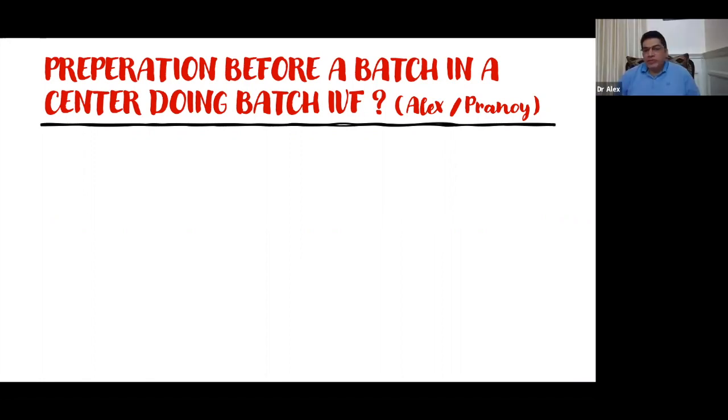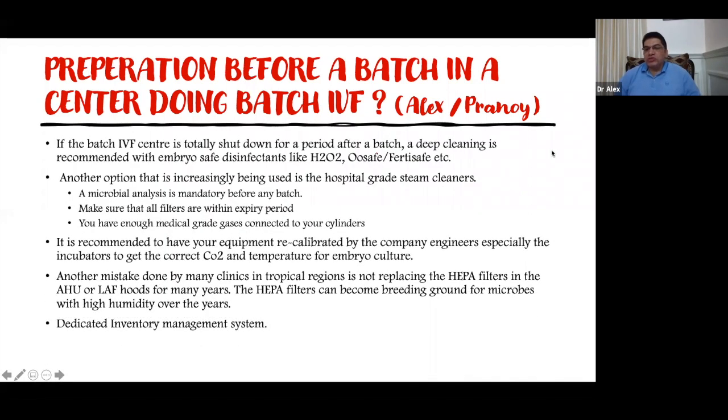This is a very elaborate list of things, so you have to be very careful, especially since in many of the batch IVF programs, it is a freelance or visiting embryologist coming. So if it is a new facility, it is better to have your embryologist come in a few days beforehand so that he can check the systems, whether they are working properly, whether you have enough disposables and enough things in place, and whether the equipment is working properly.